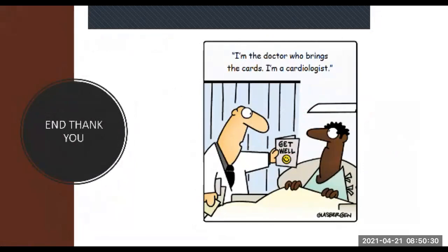The most important thing is not to worry about pathology initially when you're starting to do echoes. It is just to get the hang of what's normal. And the only way you can get the hang of what's normal is to examine patients who you do not suspect of pathology. So you've got to lie to your patients, unfortunately.